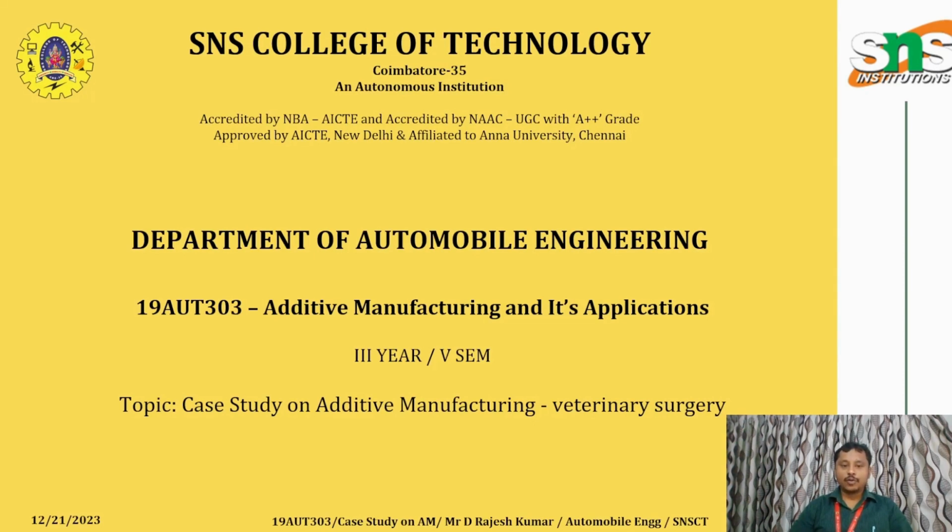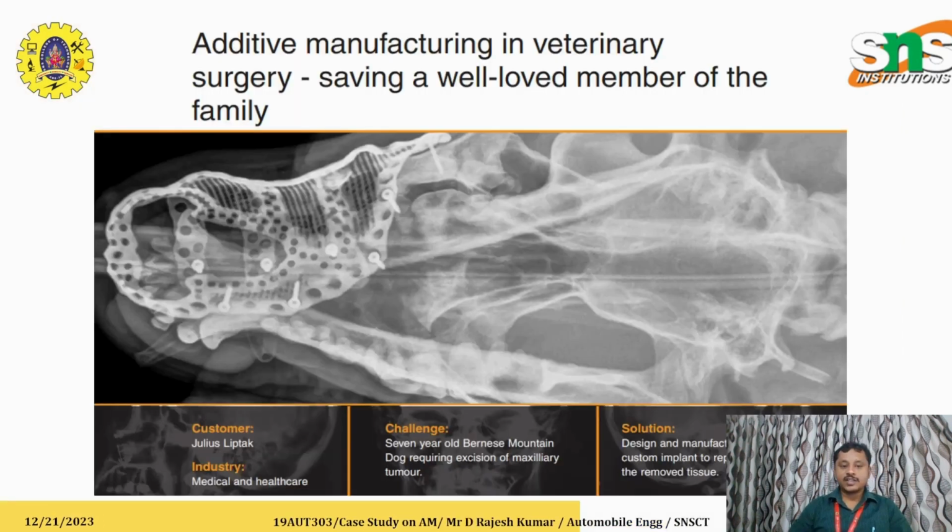We already know about the technique that is additive manufacturing. It is otherwise called 3D printing technology. It is a layer by layer printing technology. So in this case study, we are going to see about the surgery that is done on a dog. So this is the case.